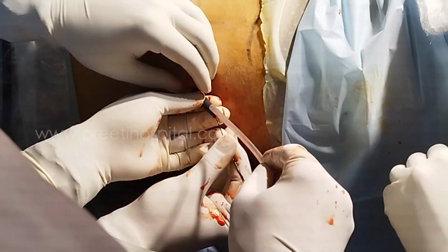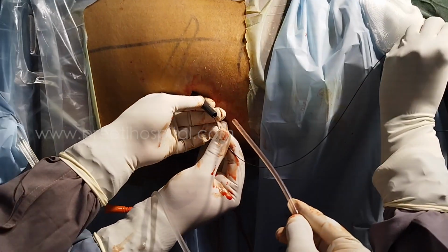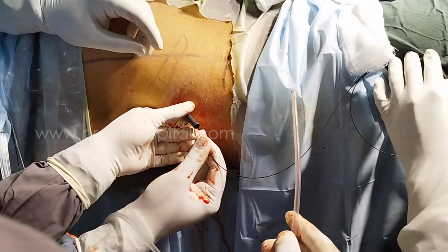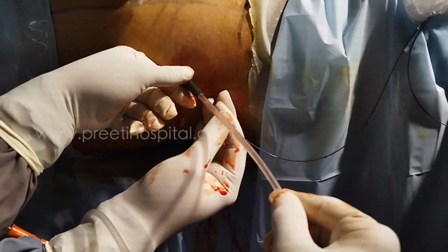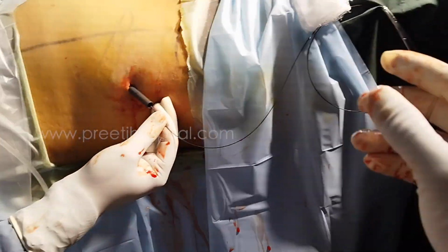Now normally I suck like this. Why? Clots. Water is not coming. So when water is not coming, you should see slowly. So it is coming now. That is a must. So suck it out. Don't do too much also, otherwise the stone may migrate. Enough.